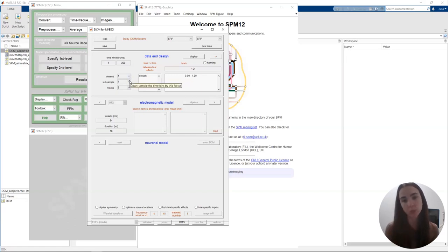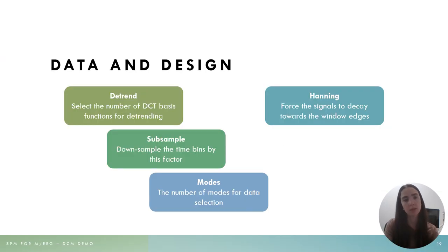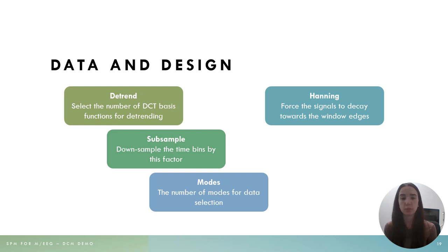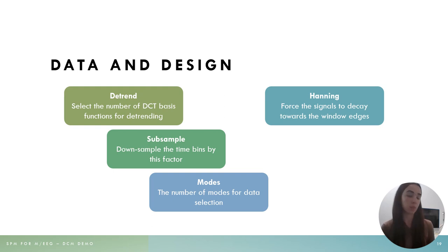There are a few more options we can choose from here — again, if you don't know what they are, just hover over them with your mouse. We can select the number of DCT basis functions for detrending, choose to downsample the time bins by some factor, and choose the number of modes for data selection. By default we use linear detrending (detrend equals one), no subsampling (also one), and eight eigenmodes for data selection. You can also choose to apply a Hanning window, which forces the signals to decay towards the window edges.